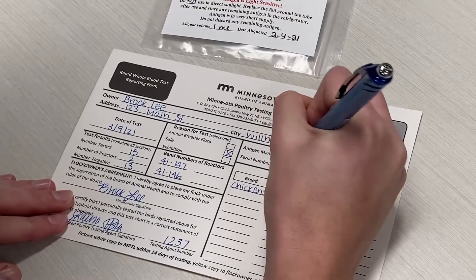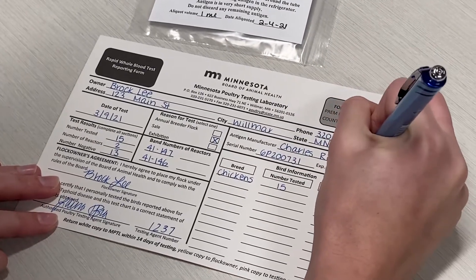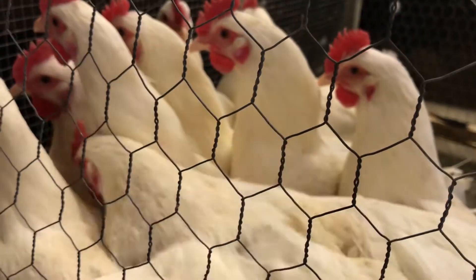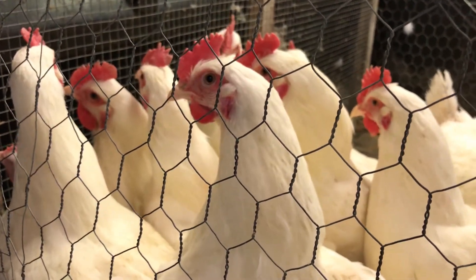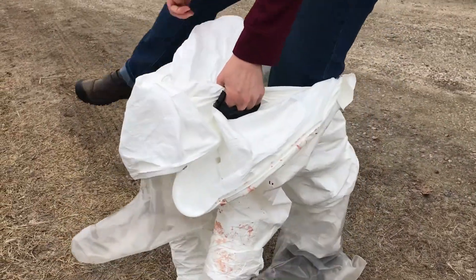When all testing is complete, fill out the rapid whole blood test reporting form completely. Make sure all banded birds are documented on the form. Also make sure that the owner has signed the form and that the address and contact information is correct. Give the owner of the birds a copy of the completed and signed form. Send a copy within 14 days to the board at the Minnesota Poultry Testing Laboratory, and keep a copy for your records.